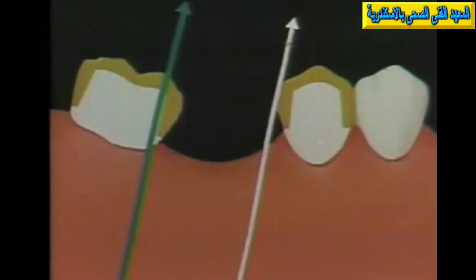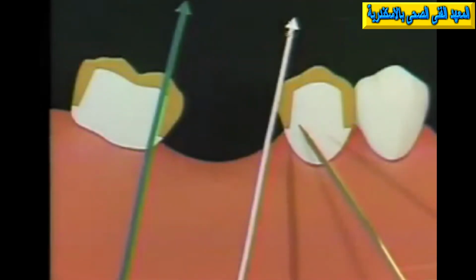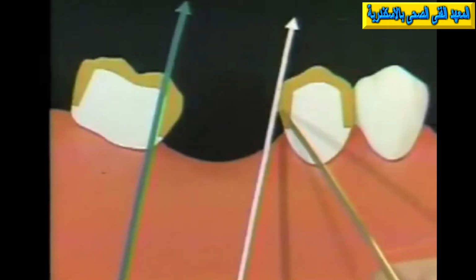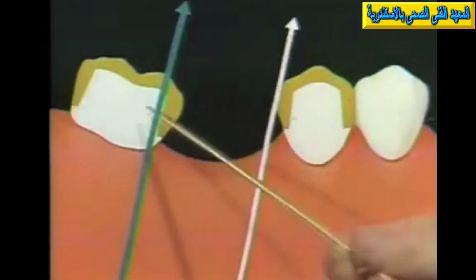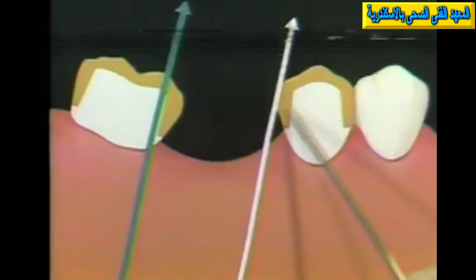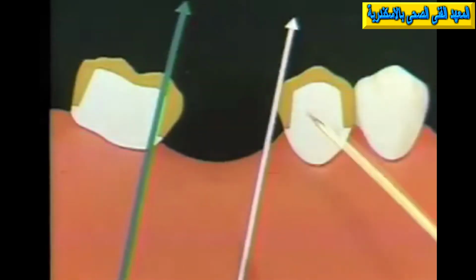And perhaps that aspect, the facing, can be best explained on this next diagram over here, which explains the reason for that faceplate. It's most commonly used and found in the case of the tilted mandibular molar, when the keyway here is being aligned with the line of draw of the mesial proximal wall of the crown on this preparation. In order to cut a keyway on here that will draw in line with that, it's necessary to cut a flat on the surface of the retainer here, so that that part of the Pontic against here will slide up that face along the same line of draw as that.